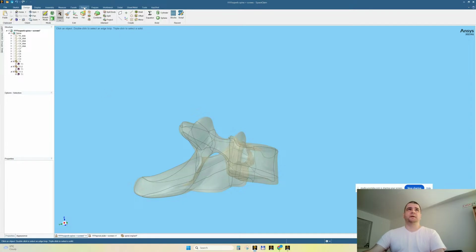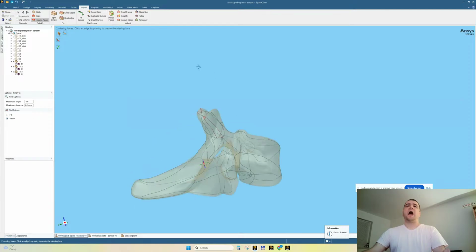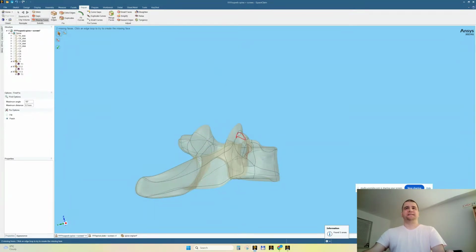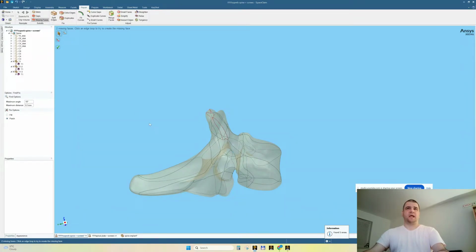So we have the repair tab. Usually I'm going for missing faces, usually. Let's see if it works with this. You know what? These faces exist. Yeah, there are these extra faces. So I will not heal as it is. Instead, because these faces exist separate, I will go for something called maybe stitch. There is no stitch, all right. Maybe gaps, no. So it's done.